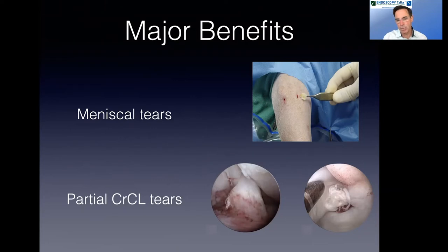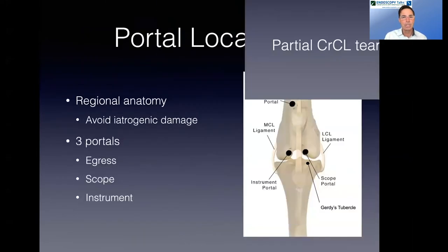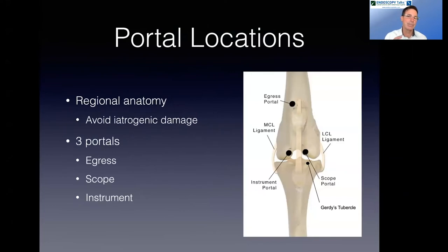And on the image on your right, you can see the origin of this cranial cruciate ligament is starting to tear. Now you wouldn't even see that with your naked eye because we've actually taken the scope back to the back of the ligament and we're using that light cable to look behind the ligament and see this tear. So if you went in surgically, you might think, oh, this is a normal cruciate ligament, when in fact, it's just an early partial tear. So the scope is highly useful in these stifle injuries. And not only can you see it, you can document it.